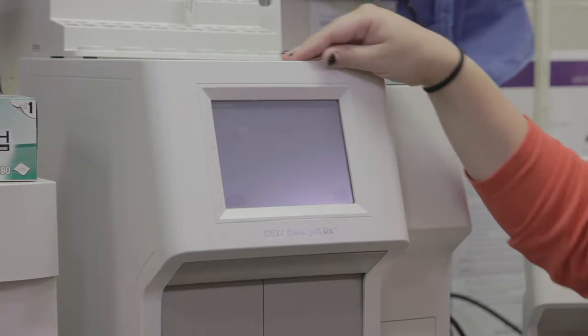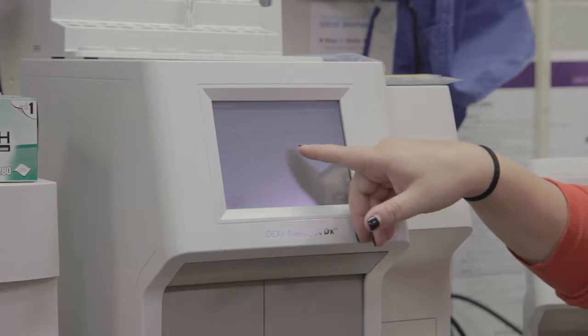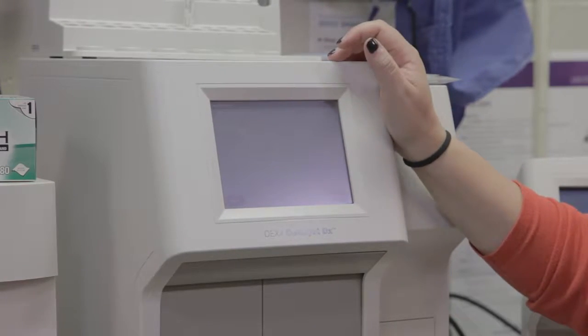If you're planning on running a urine protein creatinine ratio, you would choose urine, and then under special slide, your little UPC would light up. Other is for future development.